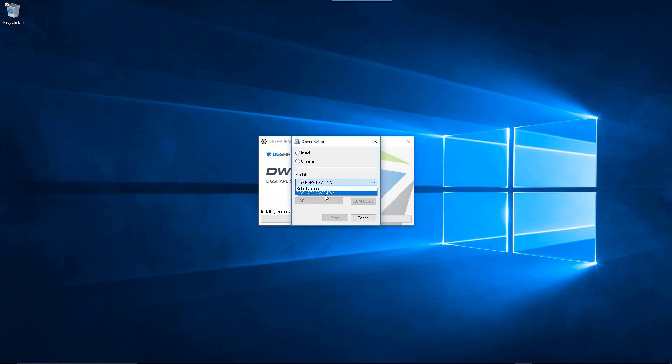Once the driver setup window appears, select the Install button. Then select the DGShape DWX-42W option from the Model menu. Leave the port setting on USB and click Start to launch the InstallShield wizard.